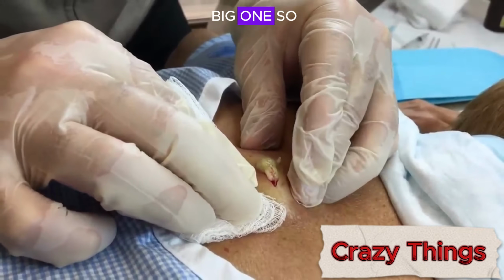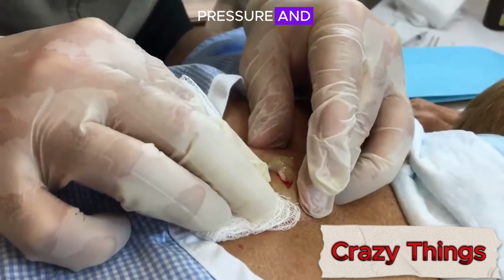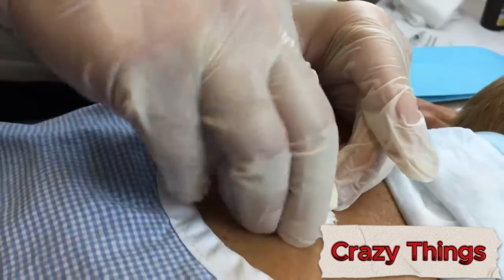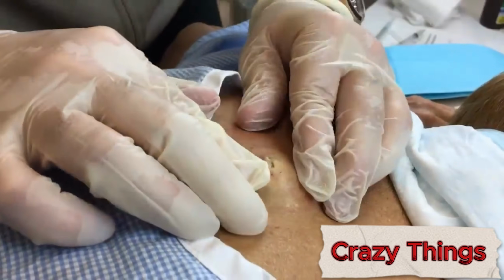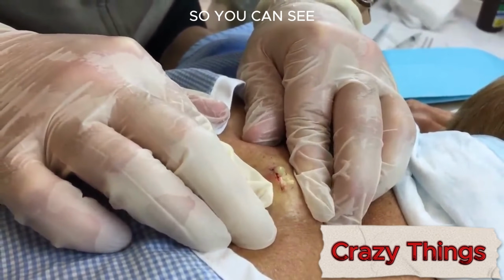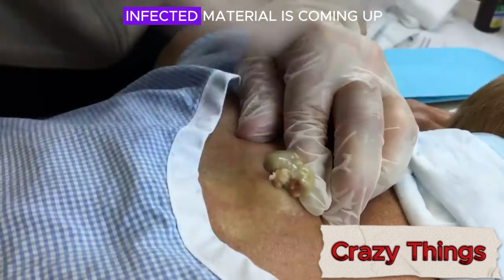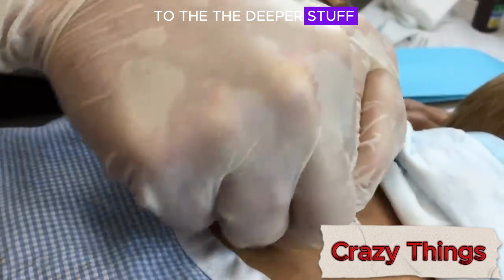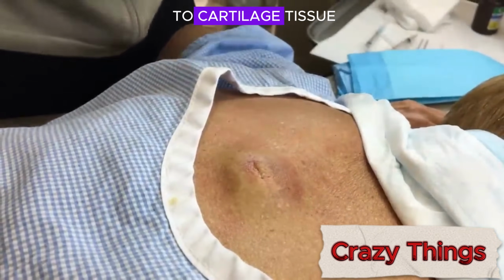And this one's a big one, so it's a balance between pressure and, you okay? So you can see how it's thicker now. So the more superficial infected material is coming up, and you're getting down to the deeper stuff. And remember, this is just a soft keratin, so it's almost similar to cartilage tissue.